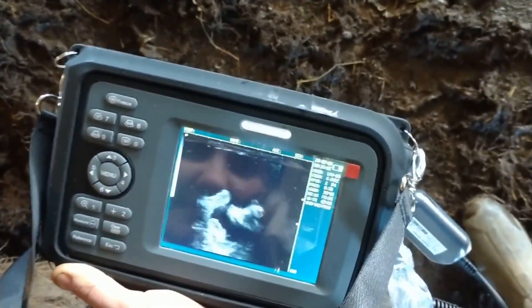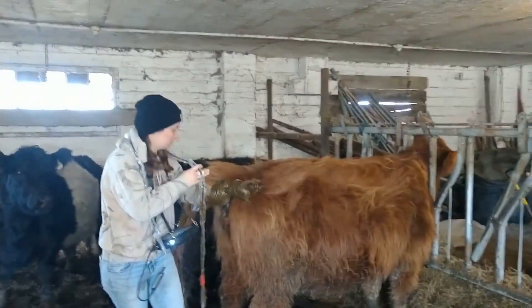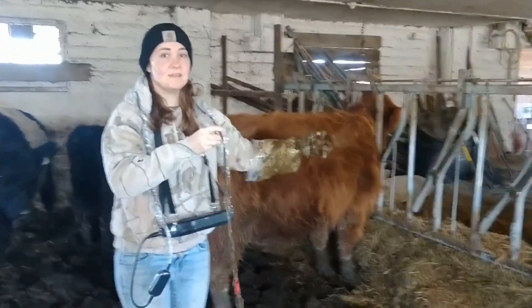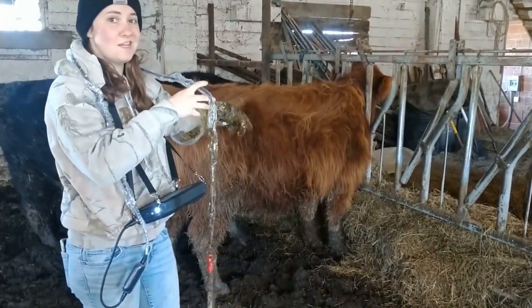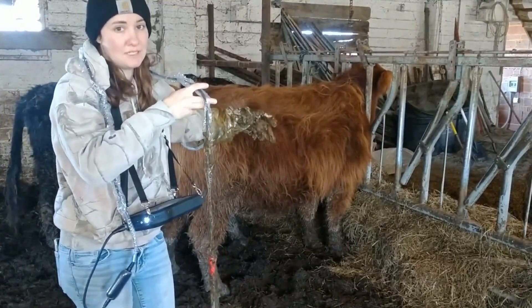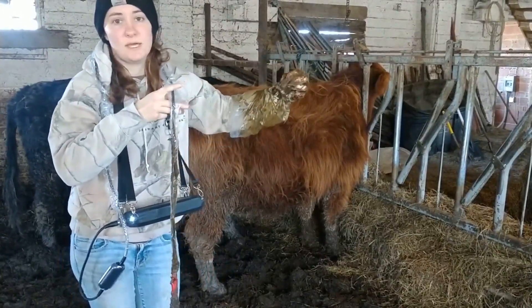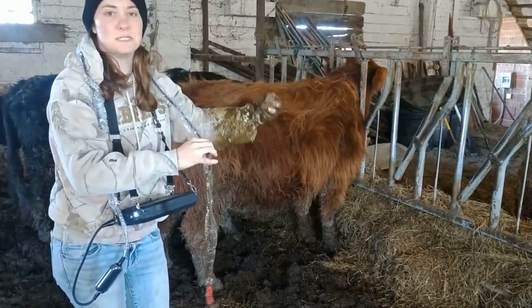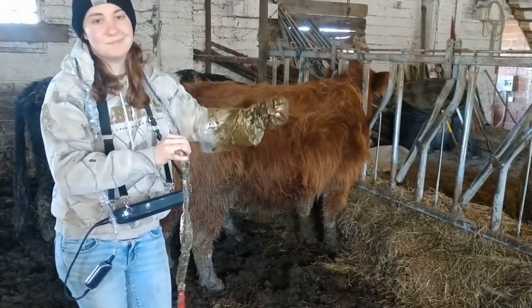And there it is. About how far along would you say she is? She is about 75 days pregnant. I can tell that by rectally palpating her — when I preg checked her at 50 days, her uterine body is a lot bigger now and she has good tone. The ultrasound is pretty cool to actually see a picture and verify that there is a calf in there.